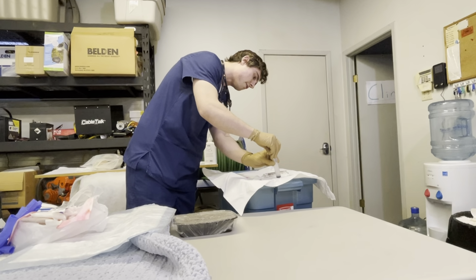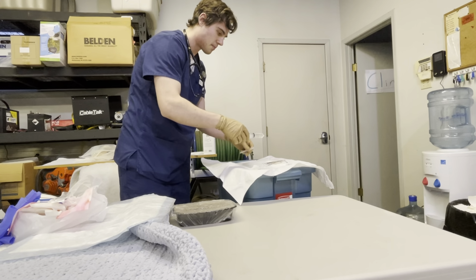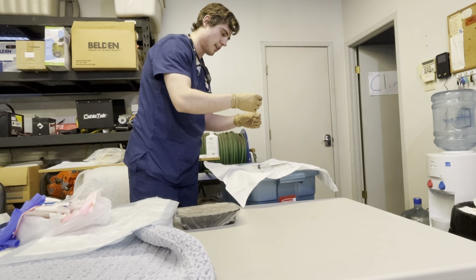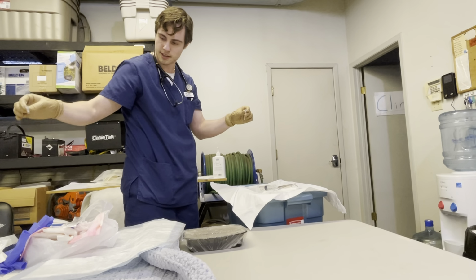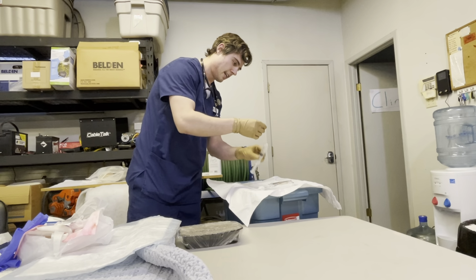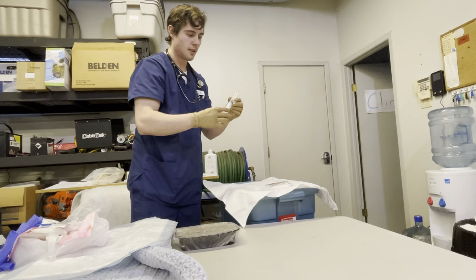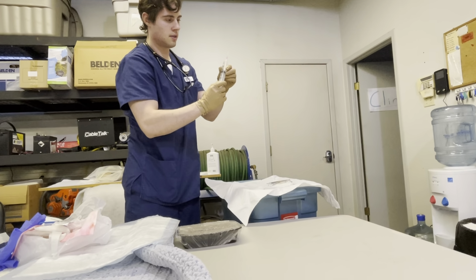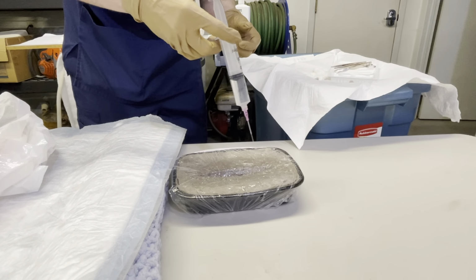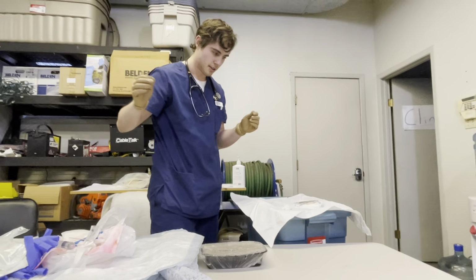So now I'm going to suck up about 15 ml for our cleaning of the wound. I'm going to take off our Cathlon, throw this in the sharps container. This is the needle part here. Throw that out. I'm going to attach our Cathlon to irrigate. I'm going to start from cleanest to dirtiest, so the center out, until the fluid runs clear, which it has run clear there, and then I will throw that in the garbage.